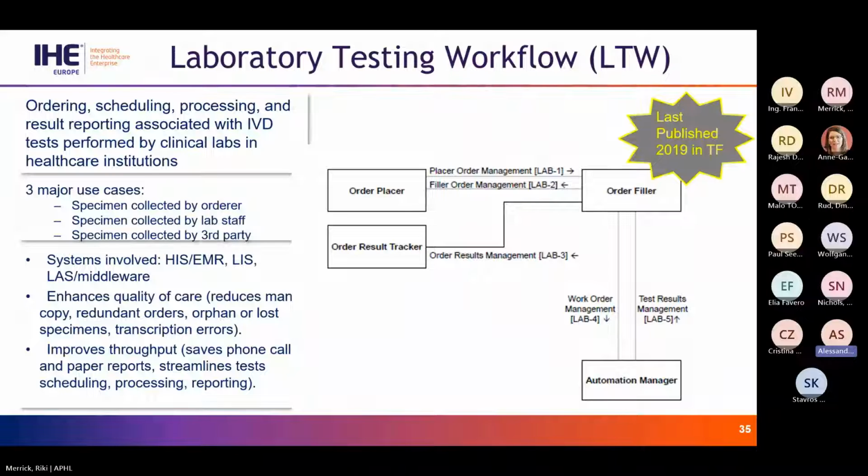So the part involving the request of a laboratory order, starting, for example, from a hospital ward, we can say. Generally speaking, from an order placer actor to the order filler, which is the lab itself, and involves as use case and transactions Lab 1 and Lab 2 that are mainly related to the order request.